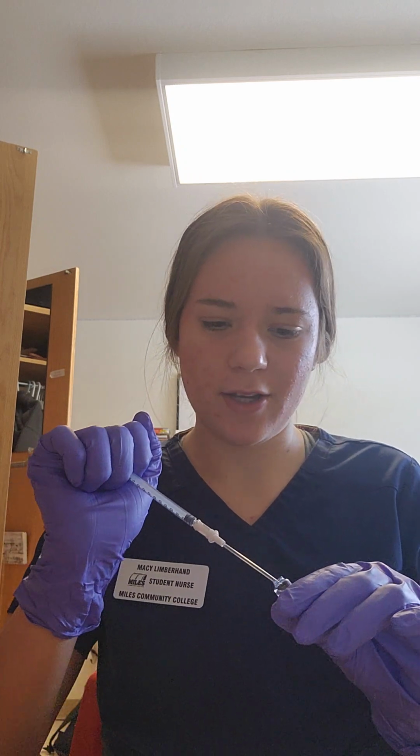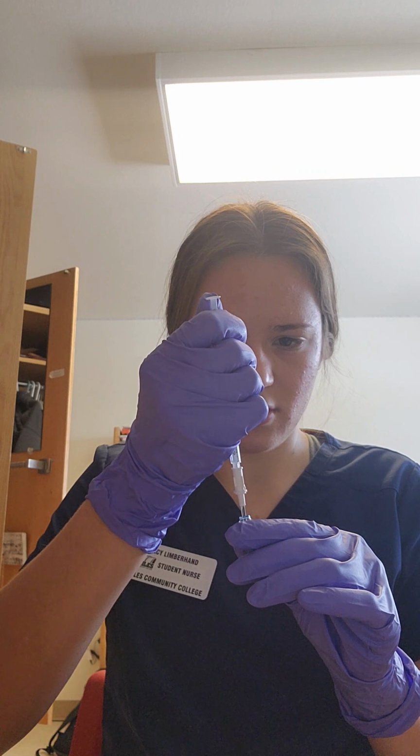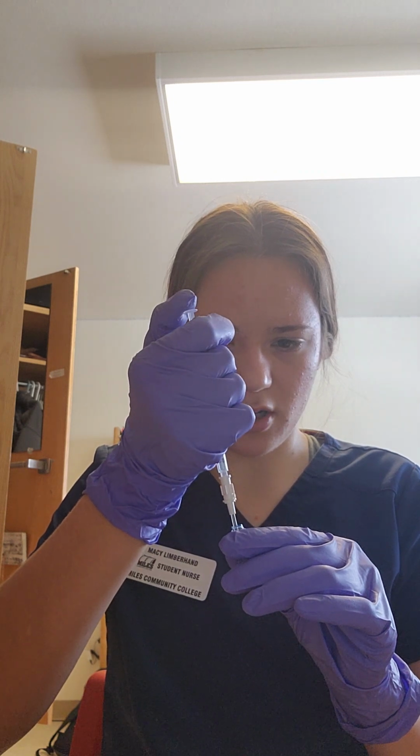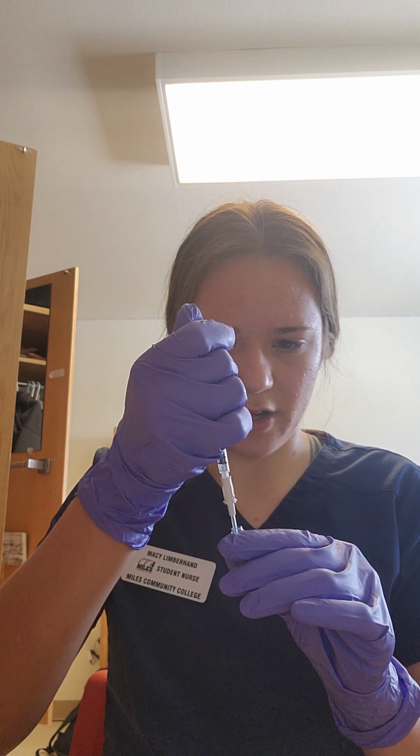There we go. I guess you don't have to draw 0.5 mils of air because it's an ampule. So just gonna let that go, and without touching the sides, I'm going to draw up 0.5 mils.